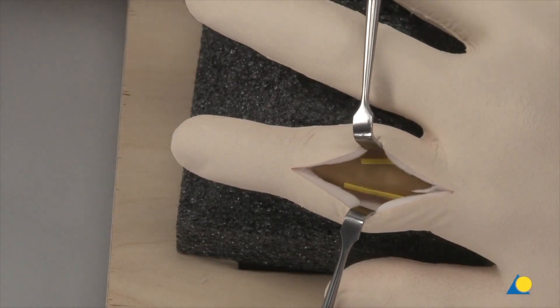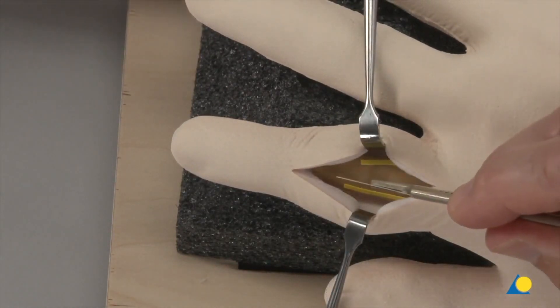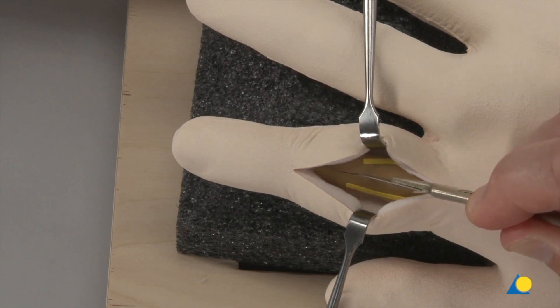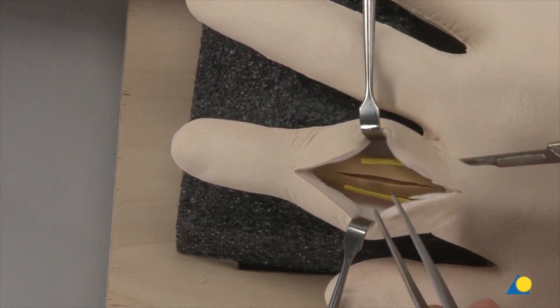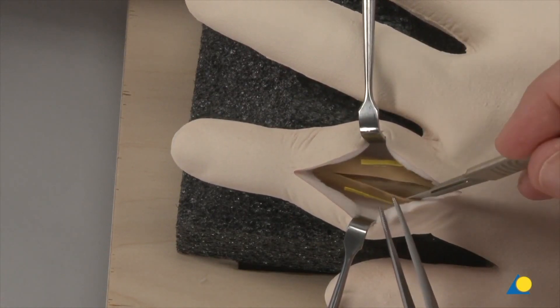After the soft tissue layer is retracted, the extensor apparatus is exposed and the central slip of the extensor tendon is incised longitudinally. The tendon insertion is carefully mobilized.